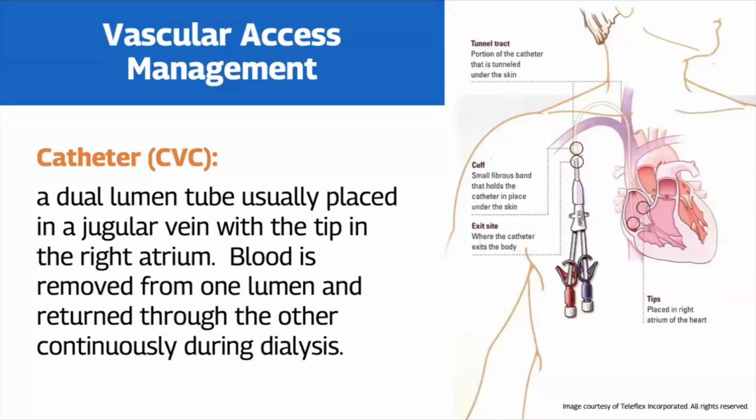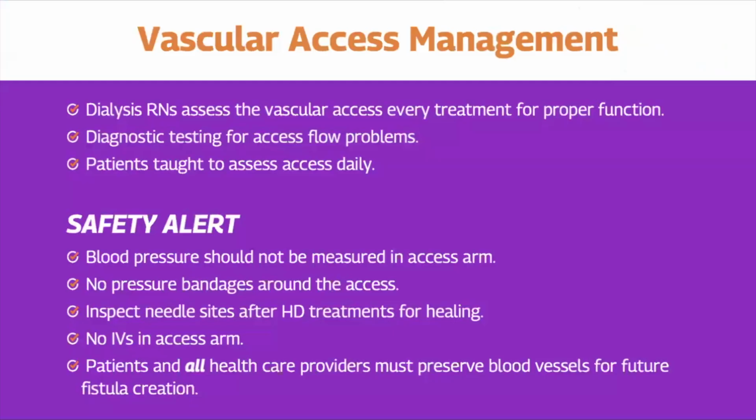So a lot of patients come to us with a catheter, and sometimes they don't have another access formulated as yet. But as soon as we get them there, within a week or so, we're talking about a peripheral access and maybe even scheduling them to have vein mapping and a look by the surgeon. So CVCs are temporary. About 10% of patients in a dialysis unit have a catheter. We'd like that to be an even lower number.